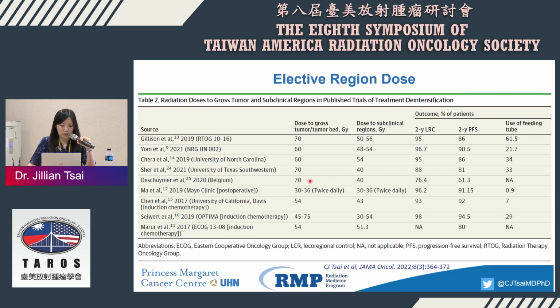If it's not surgery, not resected, it can be de-escalated on protocol to 60 or 70 gray. So that's the range of gross disease. What other trials did not actually specify is the dose to the elective, right? Traditionally, if we do 70 gray in 35 fractions with concurrent chemo, the elective dose is usually 63, 57, or sometimes 45 in a dose painting fashion.